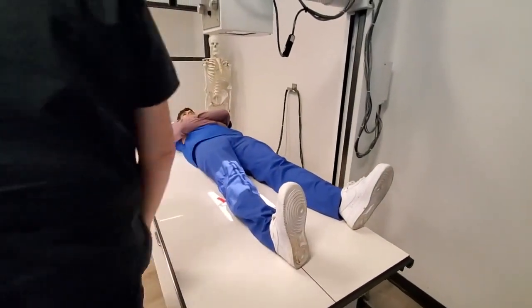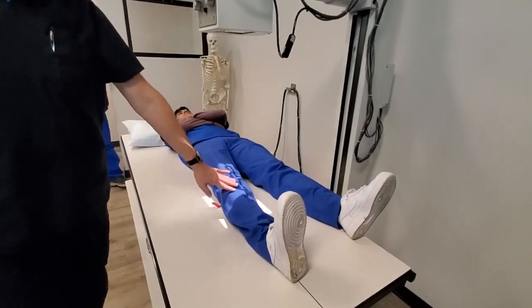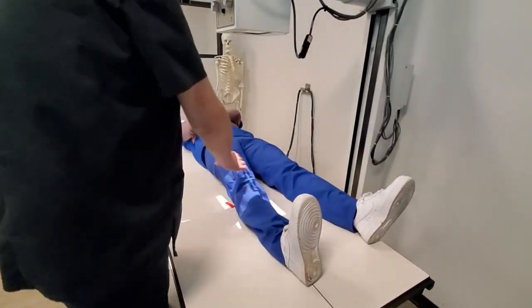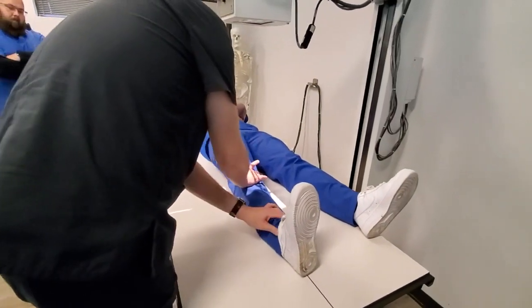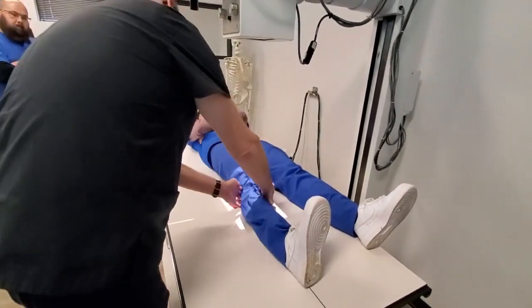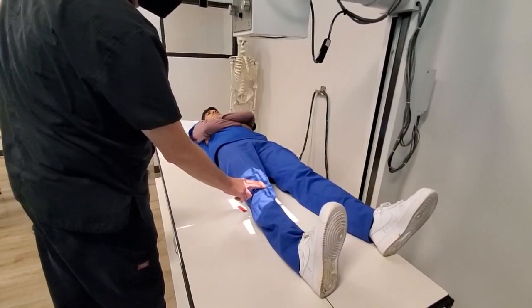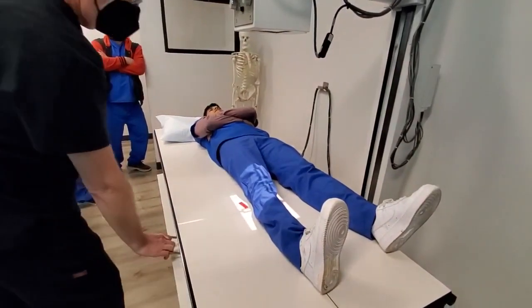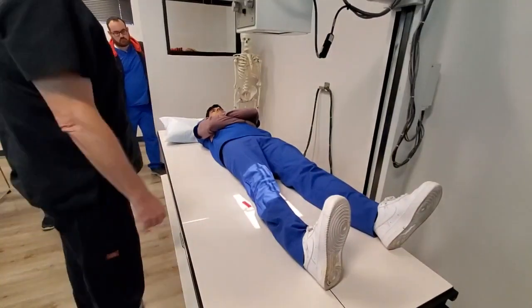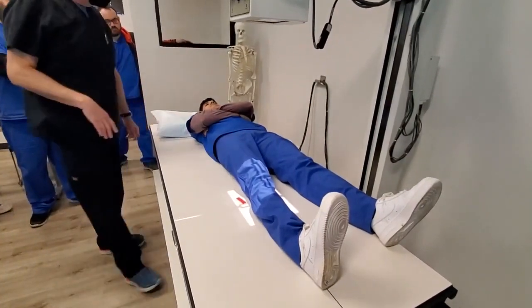How do we want these epicondyles in this projection? Parallel to the IR, to the tabletop. What do we normally need to do with the leg? Three to five degrees medial rotation to get these epicondyles parallel. Three to five is very little. I can feel the epicondyles right here, parallel with the IR. Centered half an inch distal, half an inch inferior to the apex of the patella. I'm lined up. Check that you have enough of the distal femur and proximal tip of the fibula. Tell the patient to hold still and don't move, then take the exposure. We're done.